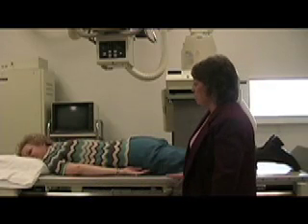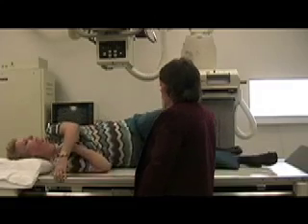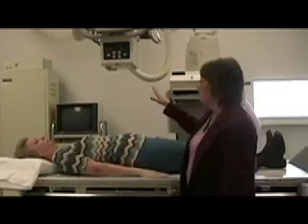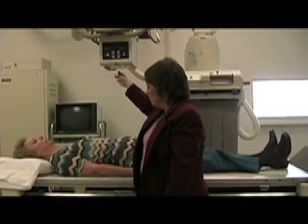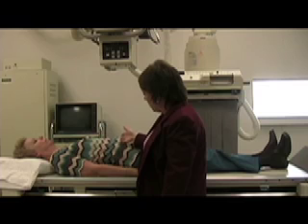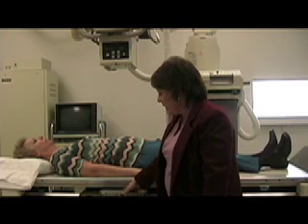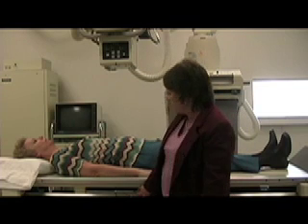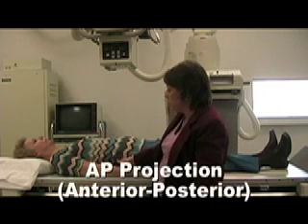We'll have you turn back over again. While we have her in the supine position, if you want to remember which projection, you can just trace the path of the x-ray beam through your patient — which would enter the anterior surface, exit the posterior surface, and then reach the film in the Bucky underneath the patient. So this would be an anterior to posterior, or AP, projection.